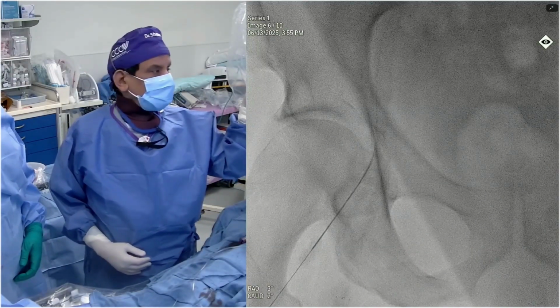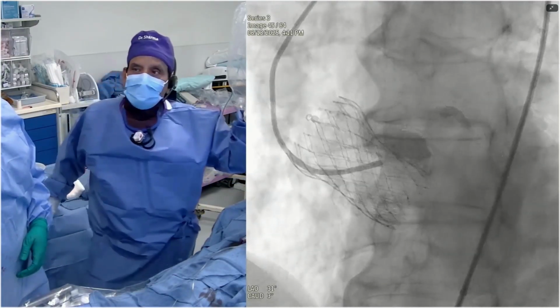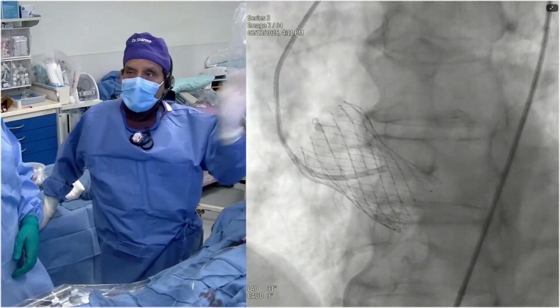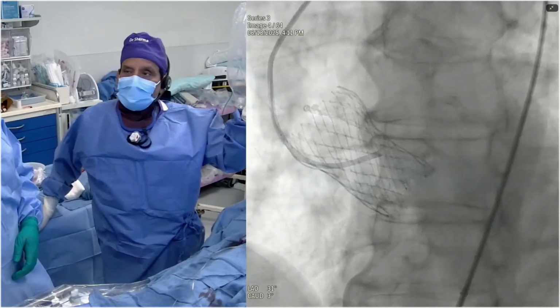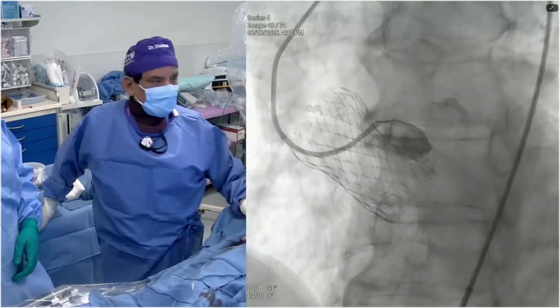So you see that basically the groin was fine. We are through the Evolut valve. We are supposed to be FX plus, but I don't think it's the commissure alignment. Look at that hole, which should be the diamond of the FX, it is not against the left main. And this is where we are. We are able to get, this is the VL30.